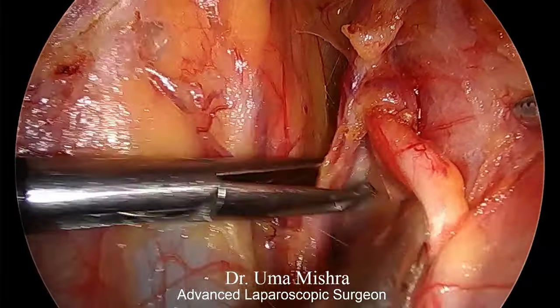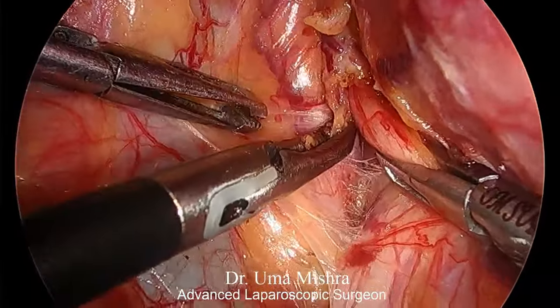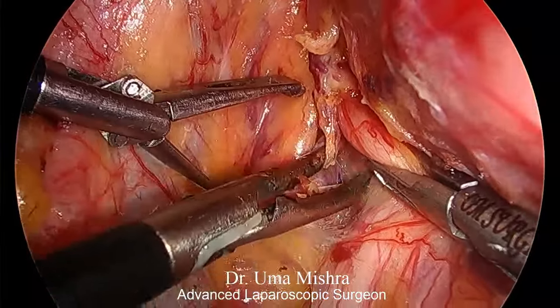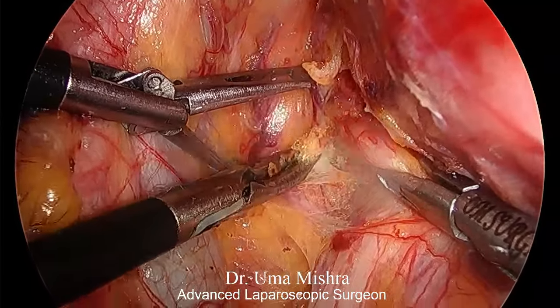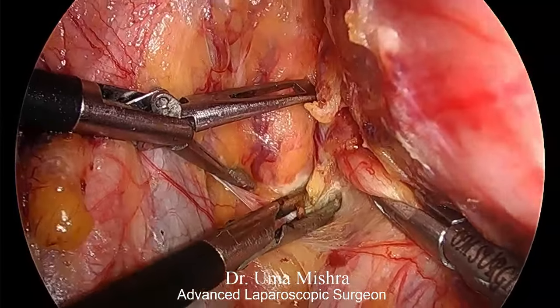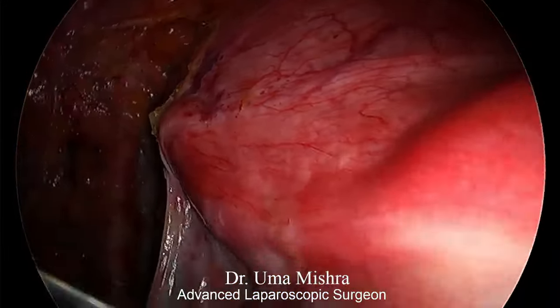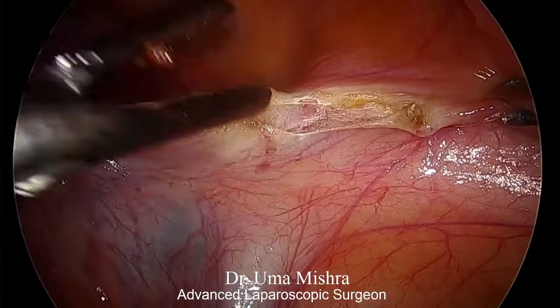So here my assistant is holding ureter and providing traction medially, and I am lateralizing vessels and taking uterine at origin. So the same procedure is performed on the opposite side.